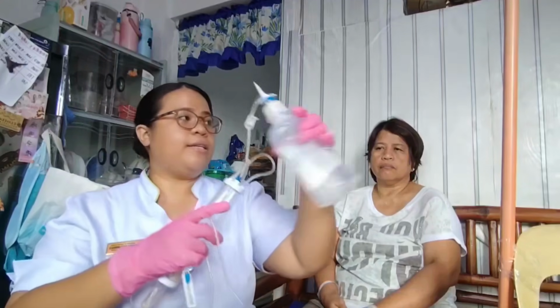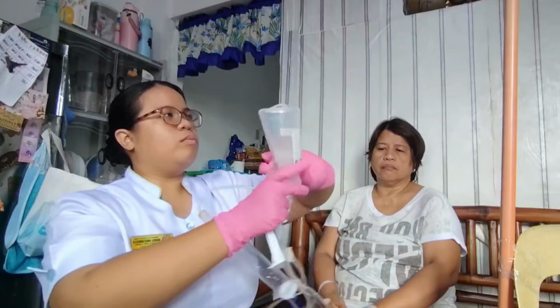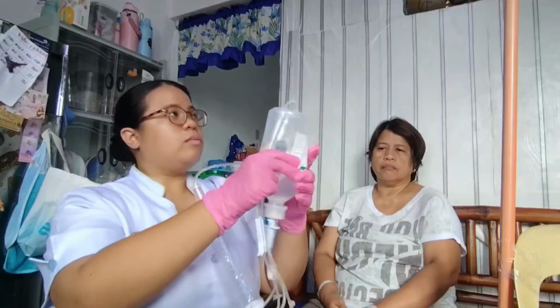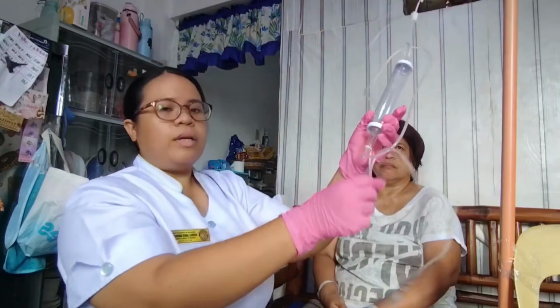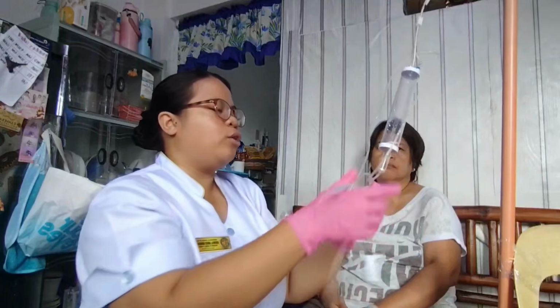Okay, so after that we're going to hang this.